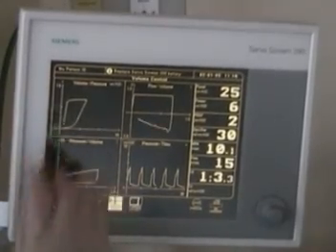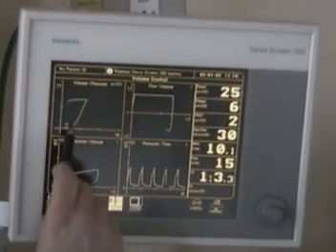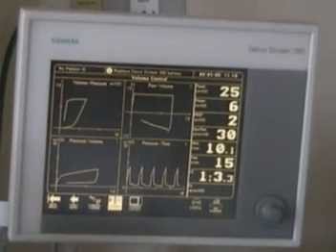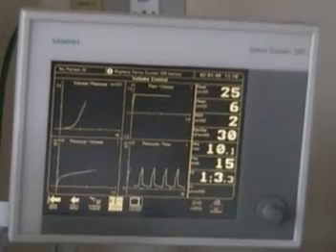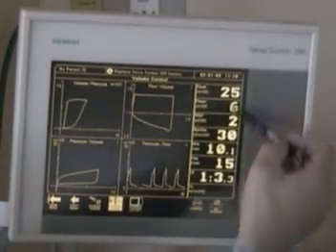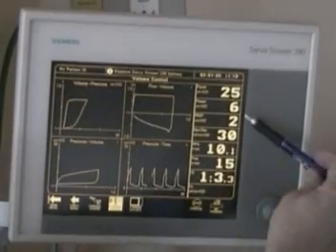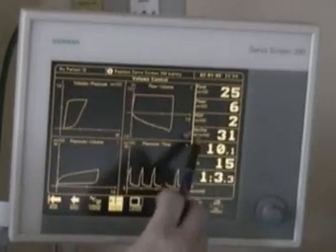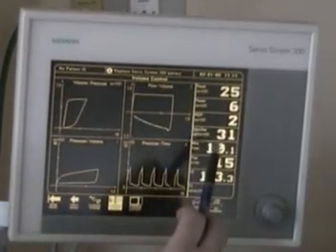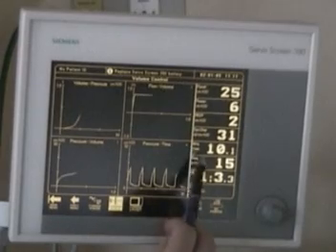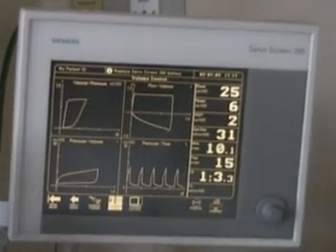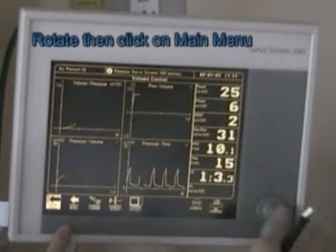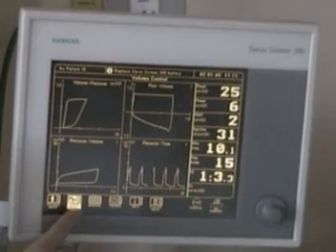We can look at these loops and tell whether or not the patient is over-distending. We can look at the flow and the volume and identify any problems occurring with the patient. In this column we have digital data that is easily read: peak pressure, mean pressure, PEEP, dynamic compliance, minute volume, breath frequency, and I-to-E.